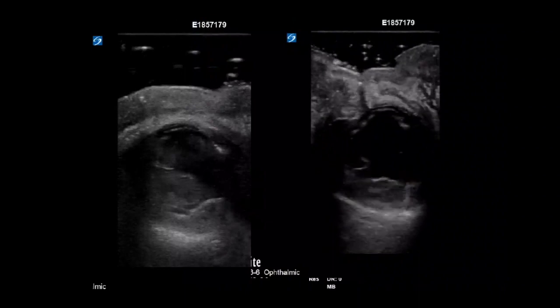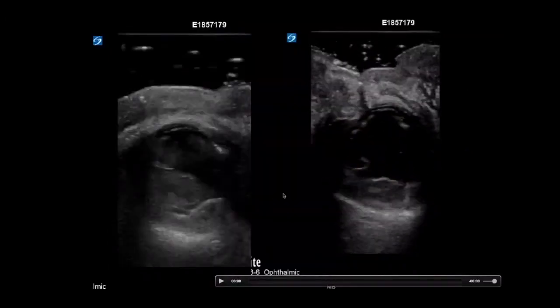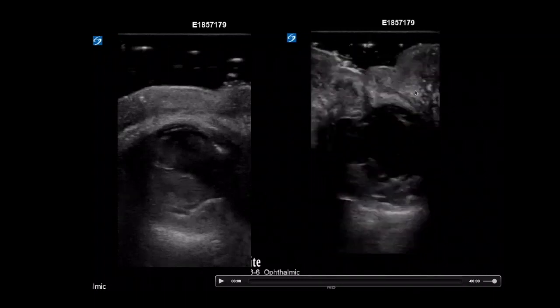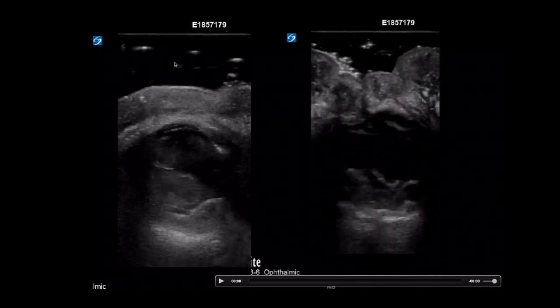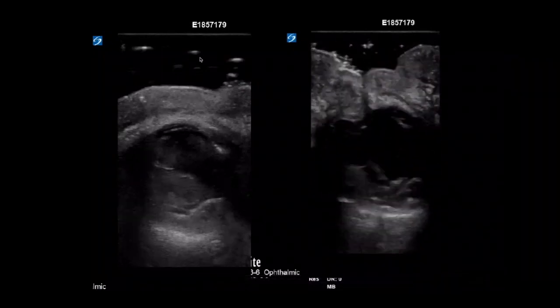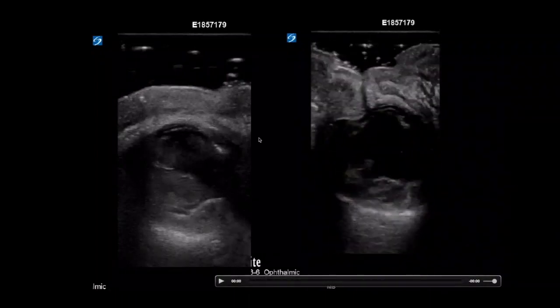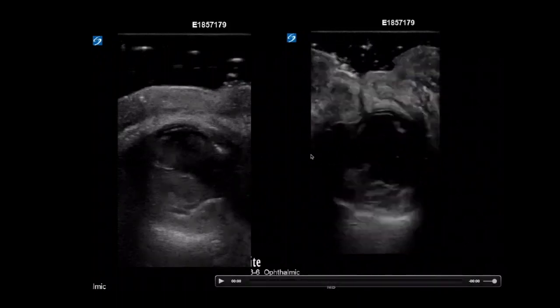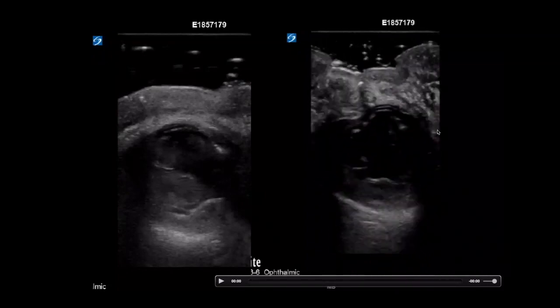This one's a little bit more clear. This is a patient I saw with one of our residents, who was struck in the face by an airbag. The patient had a very swollen eye. Notice the large amount of gel we have in this picture. You're not touching the eye at all. He was in a lot of pain. You place a probe on, and you clearly see the contour of the eye is very irregular. All you really need to do is see that. We just took 2 quick pictures. There's a lot of hemorrhage in here. This is a ruptured globe requiring an emergent ophthalmology consult.